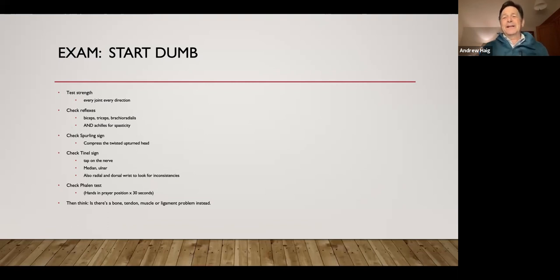So in a carpal tunnel workup, if the Achilles reflex is absent and you ask them, they go, yeah, my foot's kind of numb too. You might start your carpal tunnel workup by looking at a nerve in the foot. Because when everything's abnormal, you know, the jig's up and it speeds up your life.